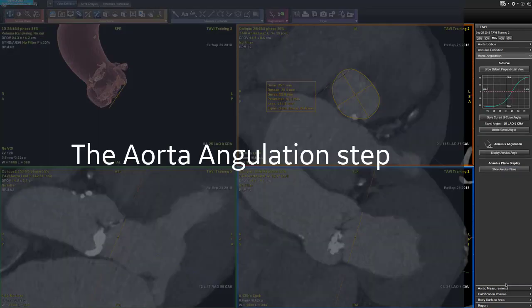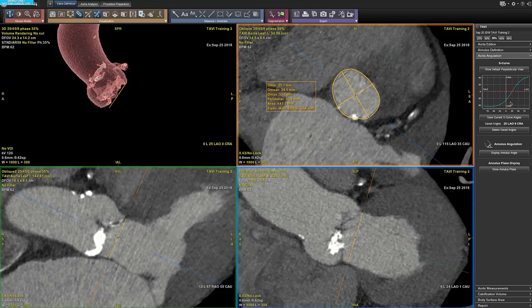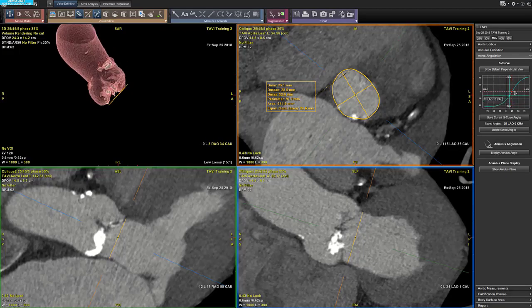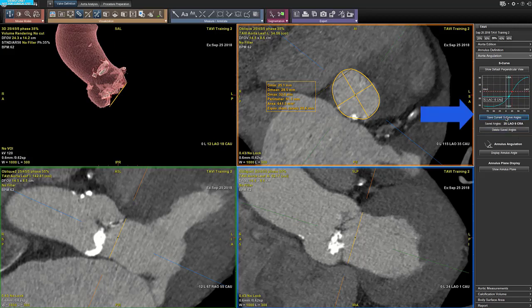We can now go to the aorta angulation step. This step contains two features: the S-curve and the annulus angulation. The S-curve in blue shows all the perpendicular angles to the aortic annulus. You can go through all the angles and see the orientation on the 3D view. The aim is to choose the optimal perpendicular view to the annulus plane that will be used during the interventional procedure. The angle represented by the red dot is the one saved by default — it is always the closest to the origin of the graph. If you want to edit this angle, you move the point along the S-curve and click on Save Current S-curve Angles. The angle will be saved on the summary table, on the report, and is displayed on the wizard panel.